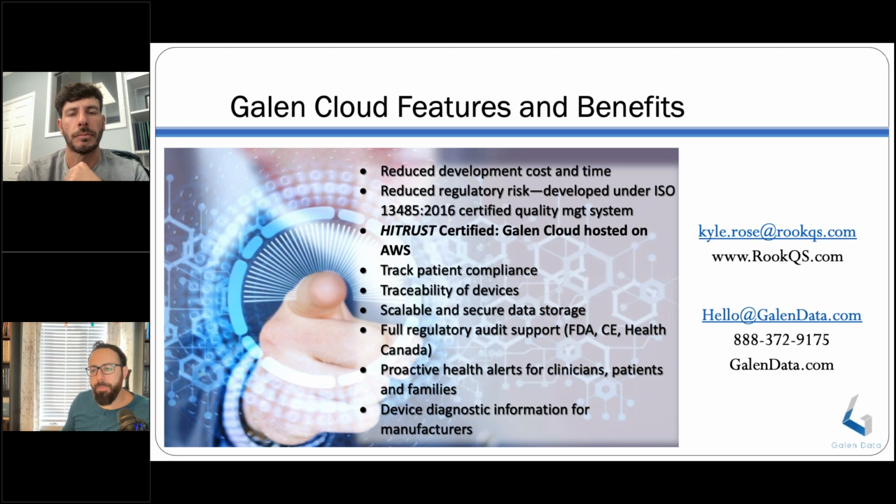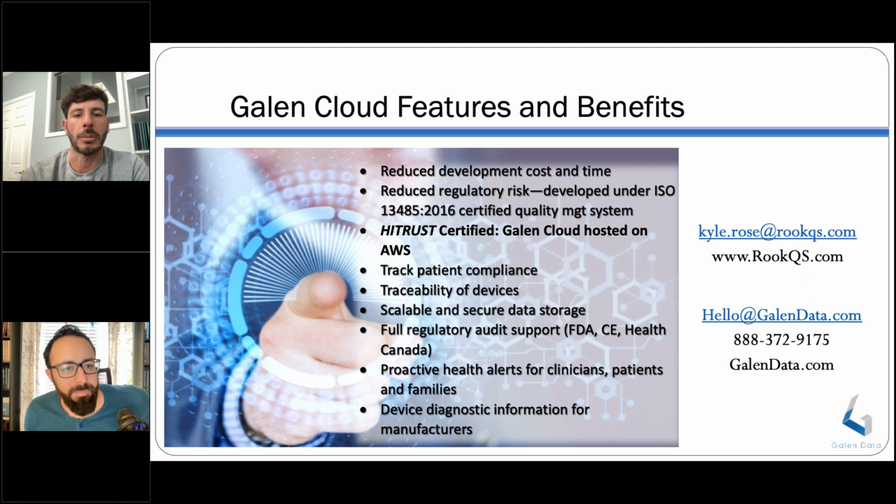Cool. And then this is the last one. Can you speak to the idea that even software as a medical device has a quote unquote shelf life? Yeah, so you still want to define sort of a life cycle of the device and how it will be put out of service. I don't think that's necessarily a shelf life. I've never used the term shelf life for software as a medical device, but you still have a life cycle and a potential end of life for the software, and that would apply for a software device.